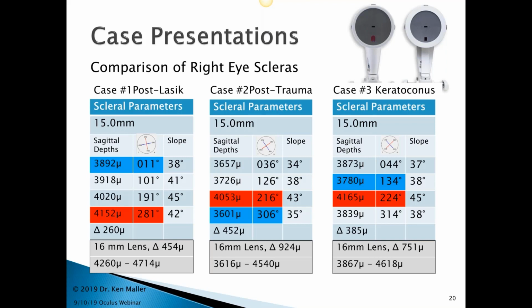The other line in the sand that would push me over into a scleral design, absolutely positively, is if I take a look at the tear film and I know that the tear film cannot support a corneal lens, that they're going to constantly have a complaint about comfort or something like that because the tear film is just not adequate, or there's garbage in it or whatever like that. Then I'll move to a scleral, almost like a knee-jerk response. Past that, it would be a case-by-case type of thing, and it would have to be a very specific reason that I would go for a scleral versus a corneal lens.